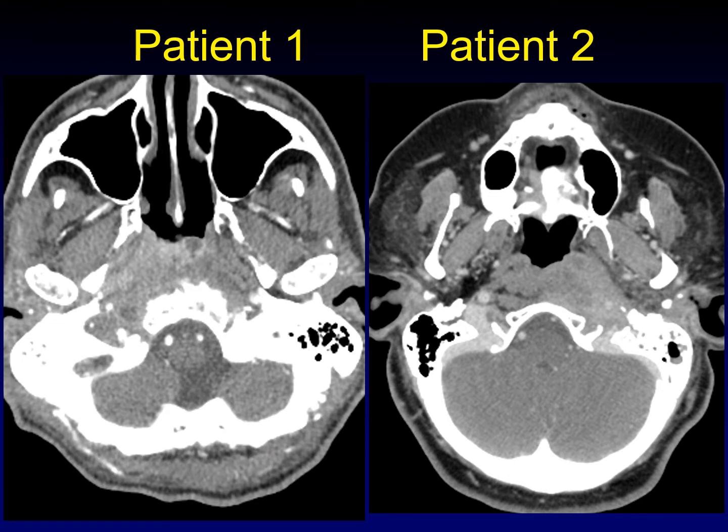These two patients look very much alike. When you see an elderly individual — usually elderly men — with erosion of the central skull base like this, there are two things that you need to consider: nasopharyngeal carcinoma and infection. Even a bacterial infection of the central skull base can have an erosive appearance, with osteomyelitis associated with it. It can look very aggressive, as can nasopharyngeal carcinoma.